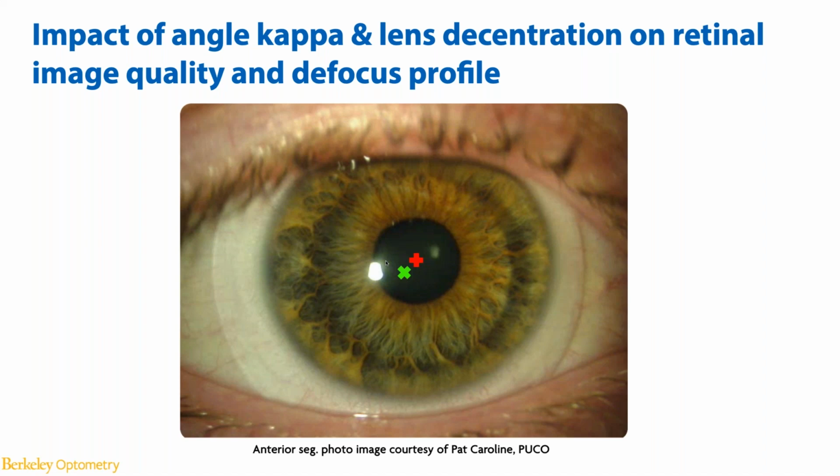So here you can see, because the direction of the pupil center or the line of sight is usually the opposite direction to the soft lens decentration, soft lenses are more commonly decentered out and down due to the asymmetric scleral elevation, versus the line of sight, which is more commonly offset in the superior nasal direction. And if this is a single vision lens, usually it has less impact on the optical quality or the visual quality of the patient.